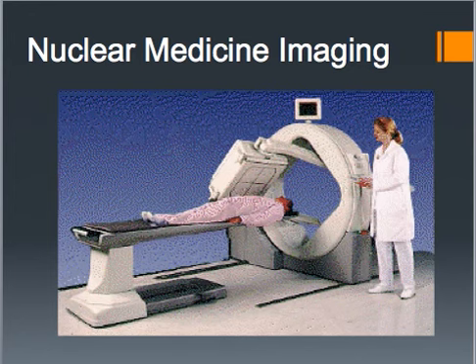Nuclear medicine is slightly different because it uses a radioactive material called a radiopharmaceutical, or referred to as tracers. Those are either injected into the body, into the bloodstream, swallowed, or inhaled as a gas. These materials will accumulate in the body in areas where they give off a small amount of energy in the form of gamma rays. The special cameras used in nuclear medicine detect this energy, and with the help of the computer, create pictures that offer details on the structure and the function of the organs and tissues.